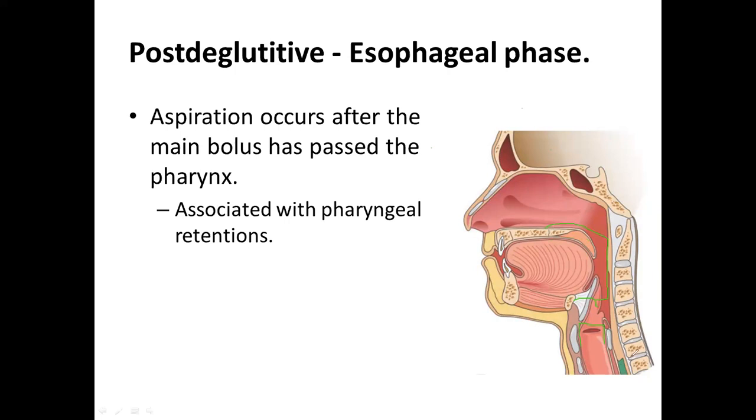This is the level where, as I was saying, if we have a stricture below the esophagus here and the contrast pools up here, definitely it will go back and find the epiglottis has already come back to its position, finding its way down to the larynx and to the trachea, leading to aspiration. And if the cough reflex is not elicited, definitely contrast will go down to the main bronchus and to the bronchial tree.